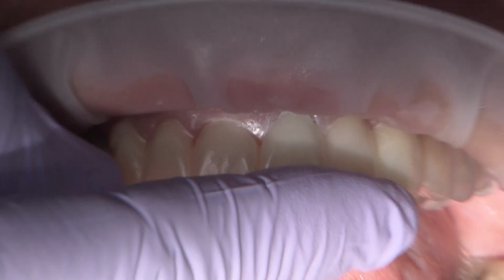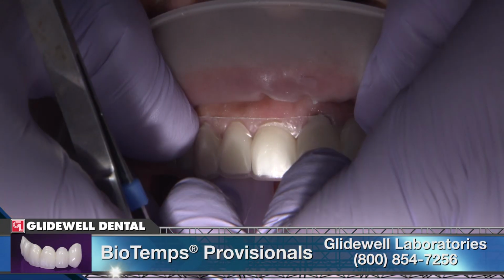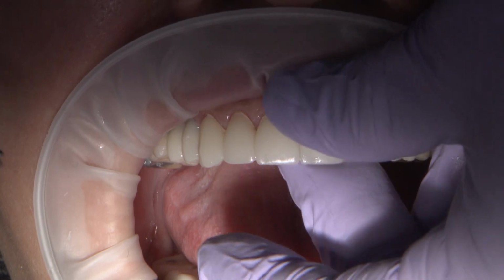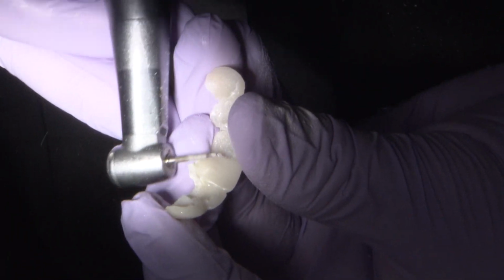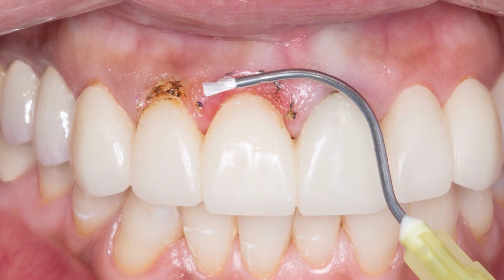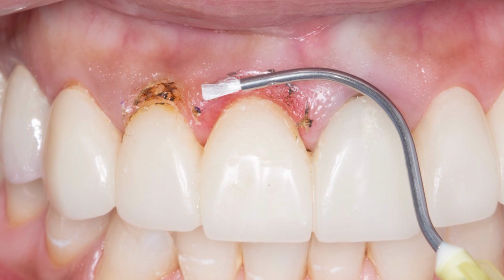After completing the external bleaching, the patient was provisionalized with Biotem's temporary restorations. Biotem provisionals are patient-specific temporaries. Their morphology more accurately matches that of the final restoration and is helping to shape the gingiva so there will be no surprises at the patient's final visit. I can use these provisionals to train the gingiva after the gingivectomy I perform above 7 and 8 with the goal of matching the gingival architecture of tooth number 9 and 10.